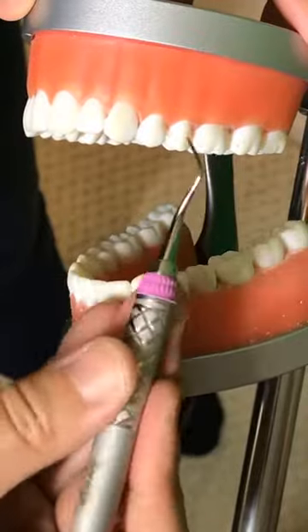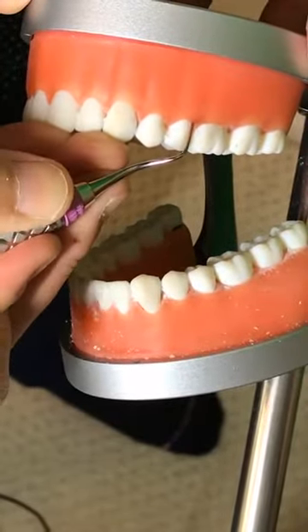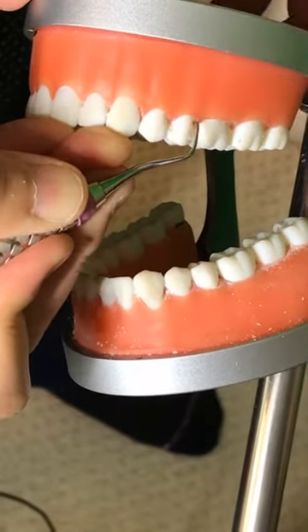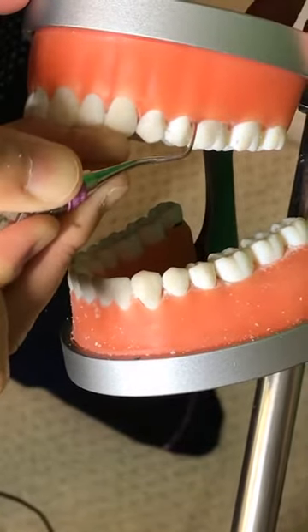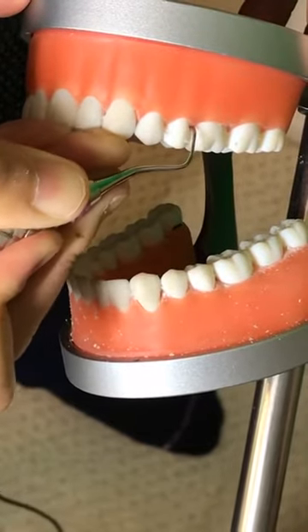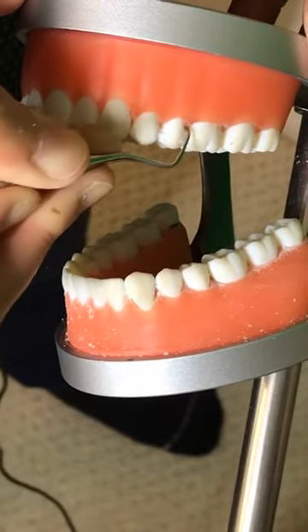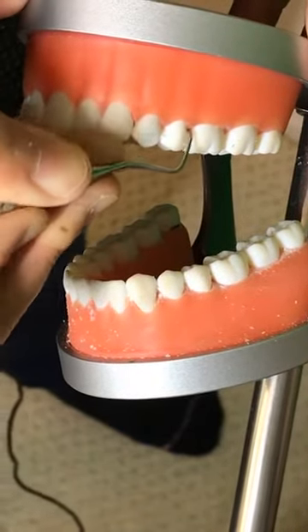For the posterior, this is a tricky part, but here you're going to use the V, or this point, towards the distal, and then close this terminal shank a little bit more. I don't know if you can see that.